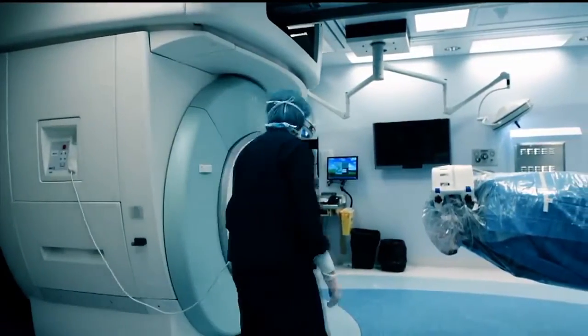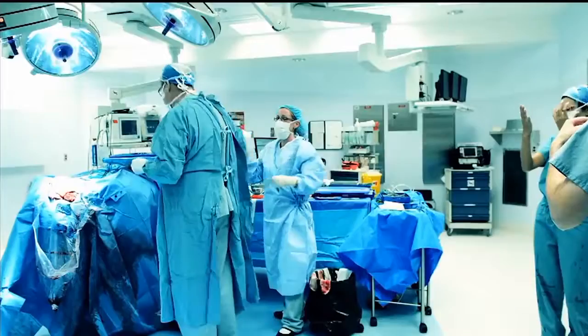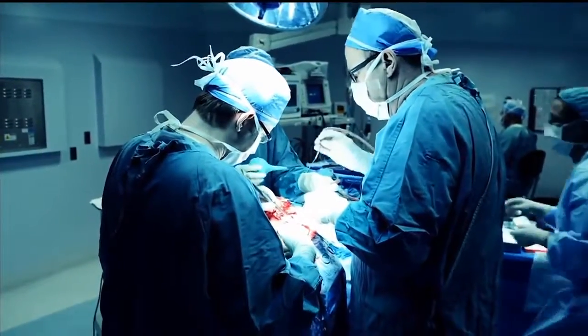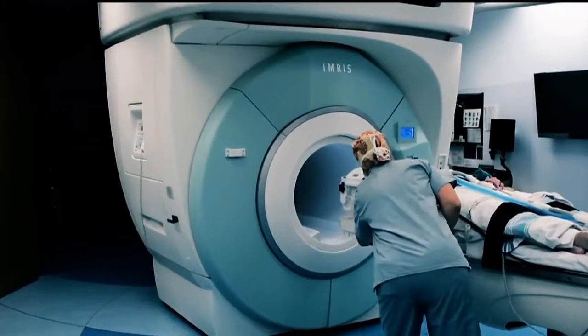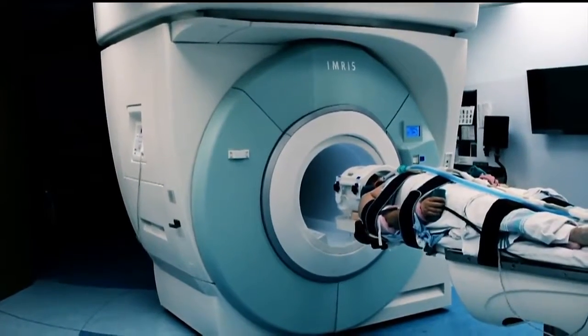Tell me how the MRI is involved with that. If you have a neurosurgical or neurological problem, you will commonly go see your doctor, and your doctor will send you for an MRI. An MRI allows your physicians to see inside your body, specifically your head. So we can see your brain, and we can see the problem that's affecting your brain. Furthermore, the MRI gives even more information, like where the important areas in your brain are that need to be avoided, and it can even display the connections between the right and the left, and within the hemispheres of the brain. So we have this rich data set of your problem and its effect on your brain. Then you go see your neurosurgeon, who operates on you knowledgeable of the images, but doesn't actually operate in the image.